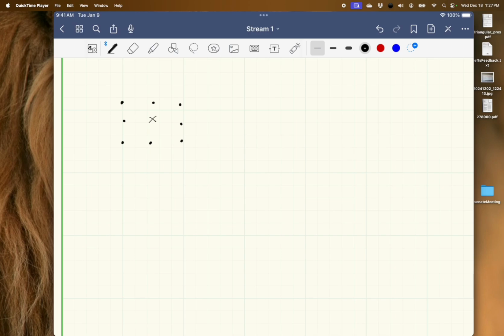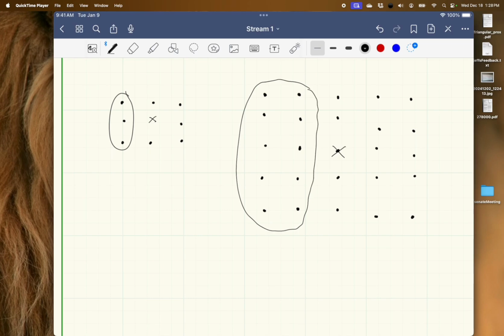This x, for this one, it would be 3 plus 2, right? 1, 2, 3, 4, 5. Let's say we had a 5 by 5 kernel. Running out of space. This is the index of the point we need to remove. I'm assuming it's the first coil now. So now it's going to be 5 times 2 plus 3.